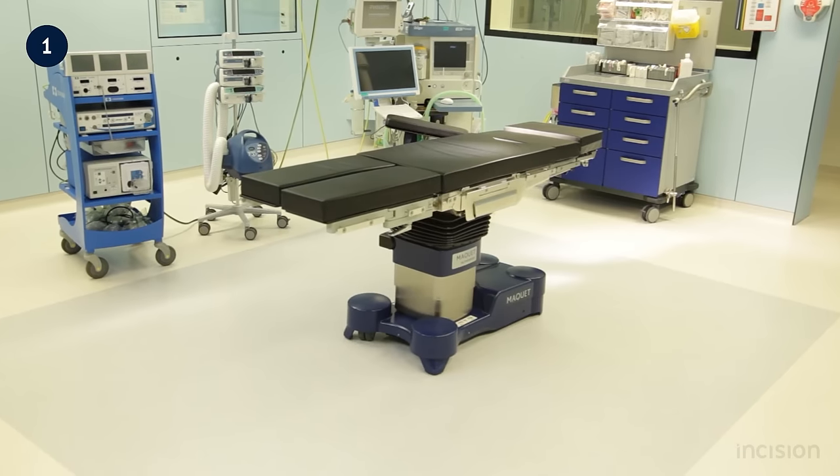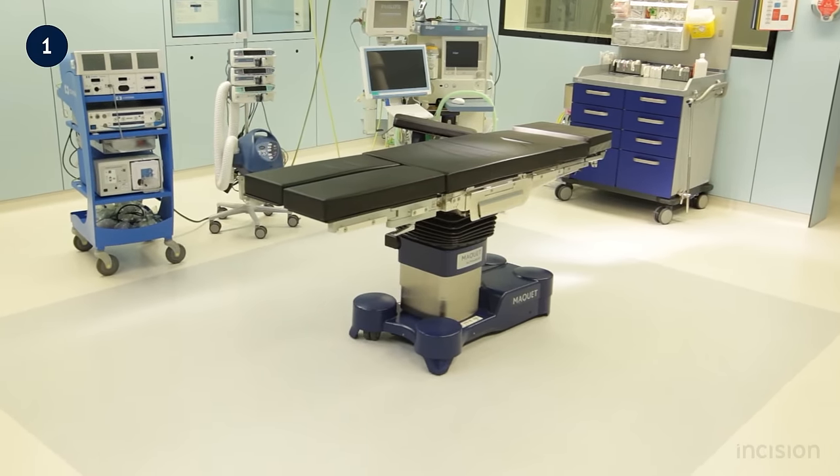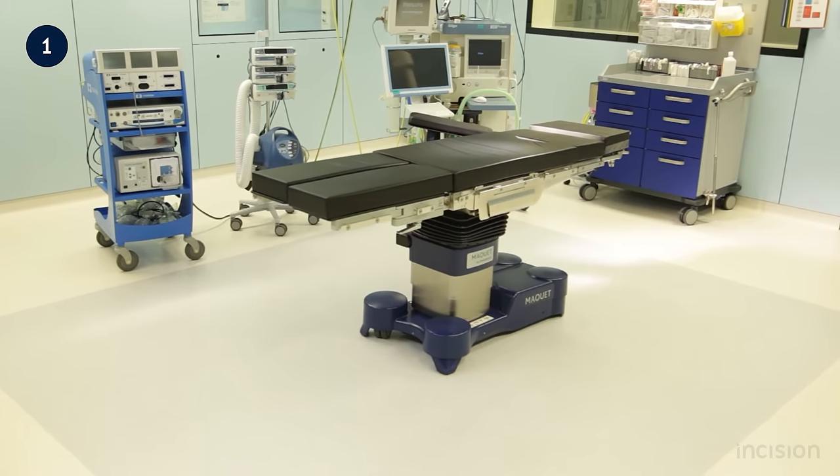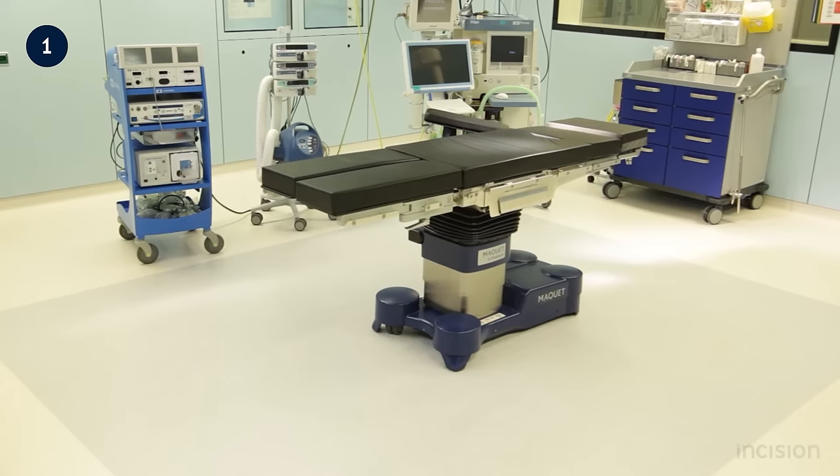The surgical table is an OR specific piece of equipment. In this film, the table, its adjustments and accessories will be discussed in the context of patient positioning for surgery.